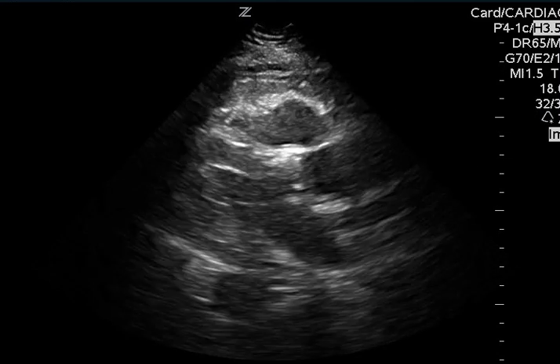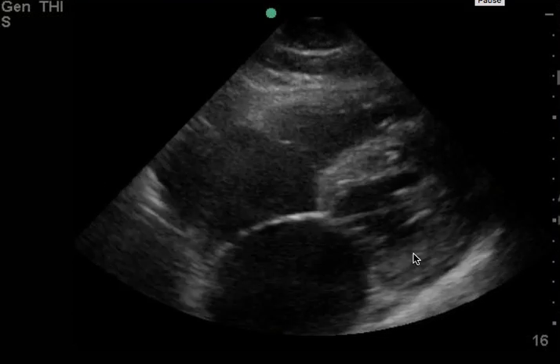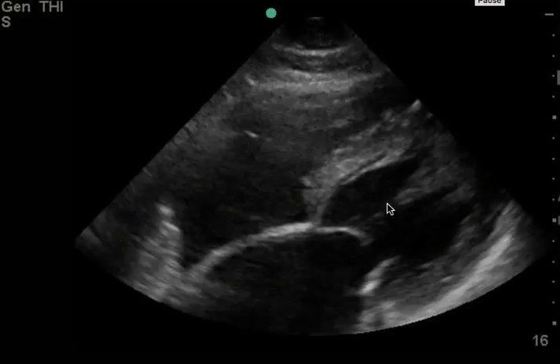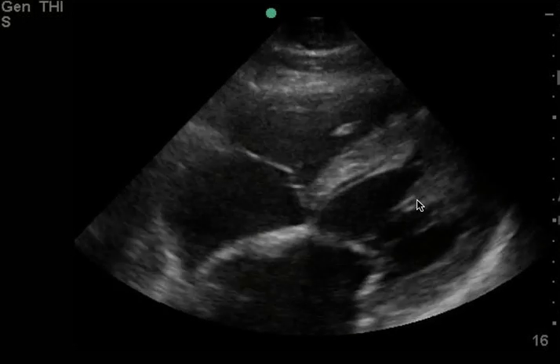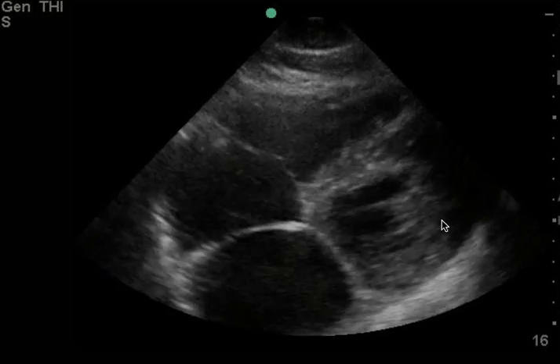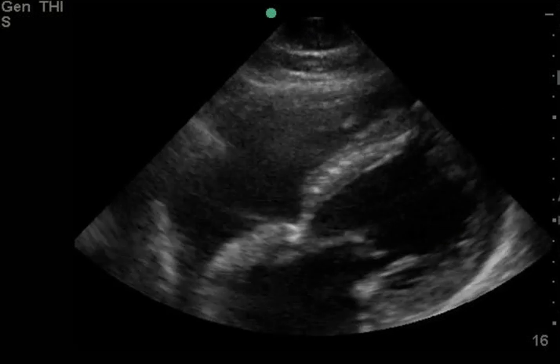Now contrast this with your patient again. I'm hoping that when you compare the two, you can see that here the walls aren't squeezing that much together and that the ejection fraction doesn't look as well preserved. I hope this video helps — let me know if you have any questions.